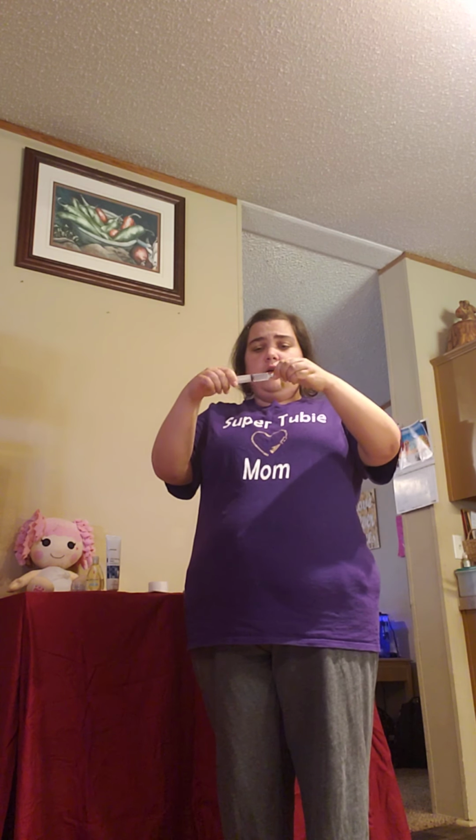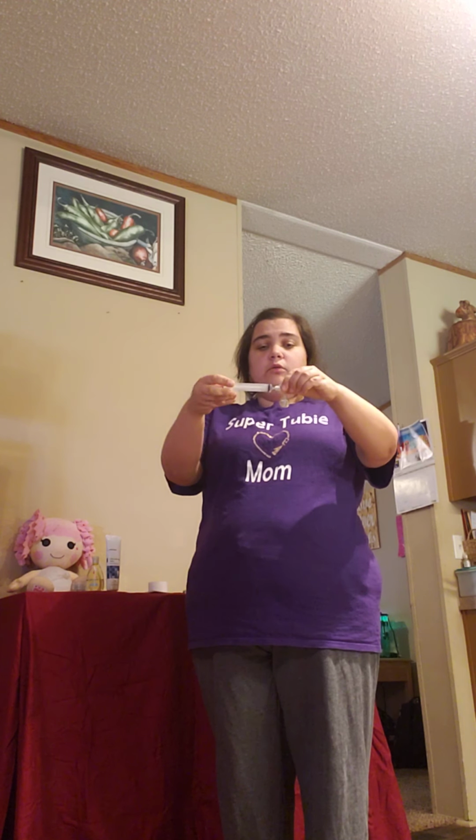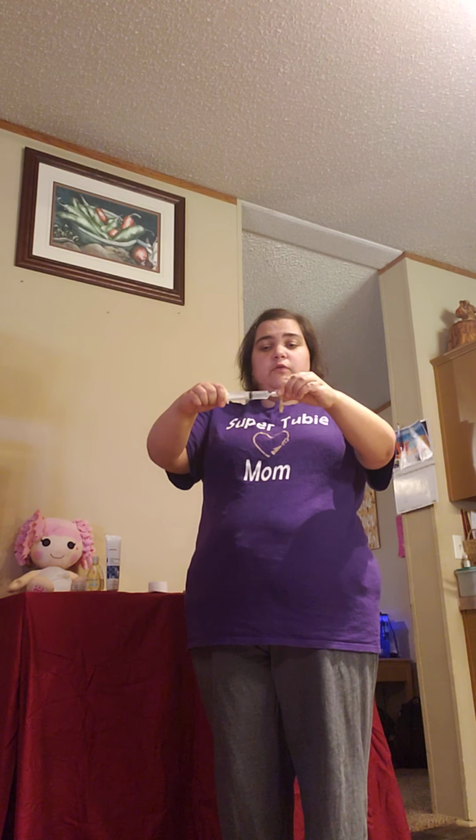The balloon is what holds your button in place. You insert it with 5 mLs of water, and it blows up a small balloon-like bubble, which holds the button in your stomach. To check this balloon, you will want to hold the button in place and remove the water that is in the balloon. Once removed, you will want to check to make sure that the correct amount of 5 mLs is in the balloon.